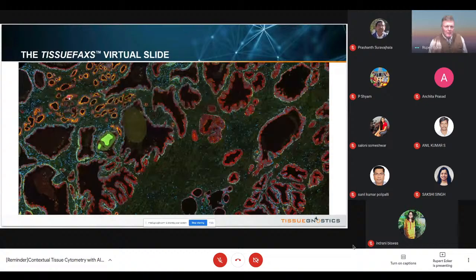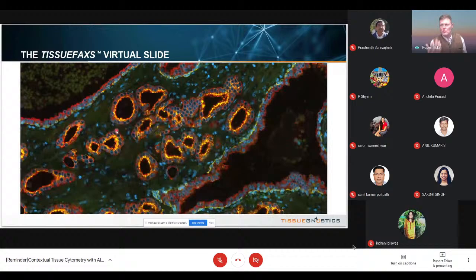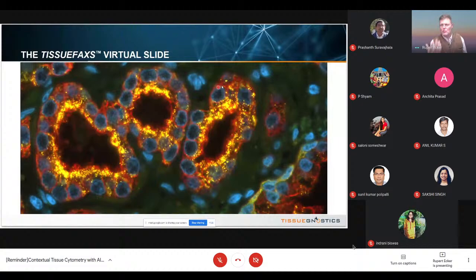Also morphologically, when we just look on H&E, we might not recognize this. Again, we can zoom in here, then we start seeing the individual nuclei in blue. This is stained by DAPI, a nuclear marker, and even further than the details of individual glands, we can really see individual cells, and those cells can be analyzed. And this is what the focus of my presentation is about.